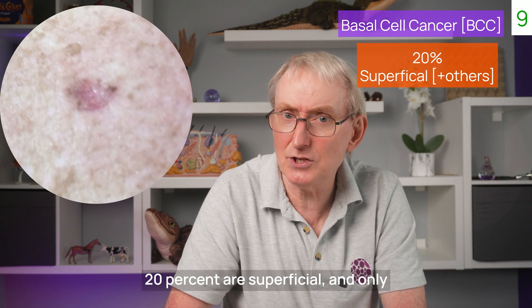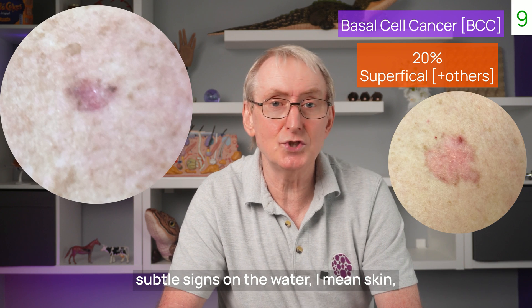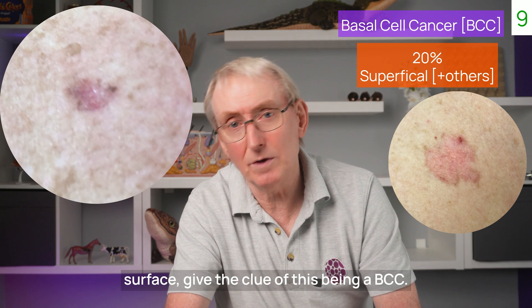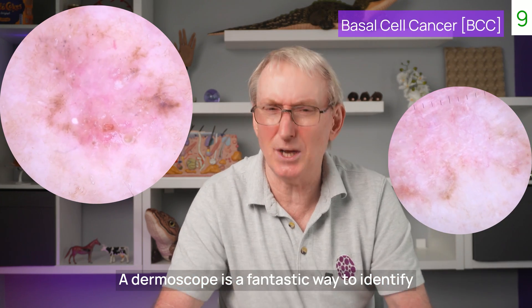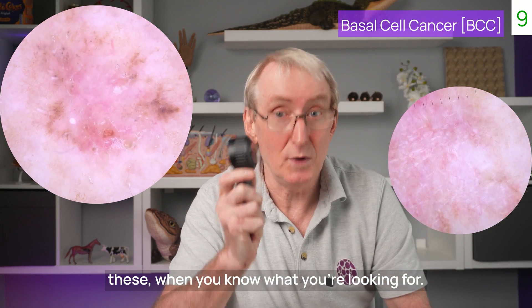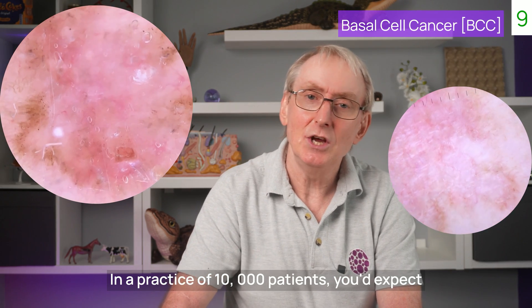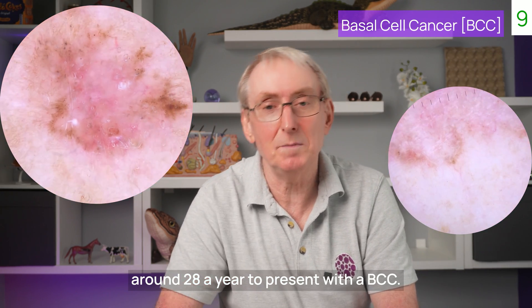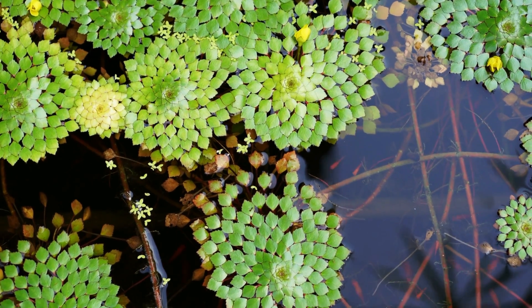20% are superficial and only subtle signs on the skin surface give the clue of this being a BCC. A dermoscope is a fantastic way to identify these when you know what you're looking for. In a practice of 10,000 patients, you'd expect around 28 a year to present with a BCC.